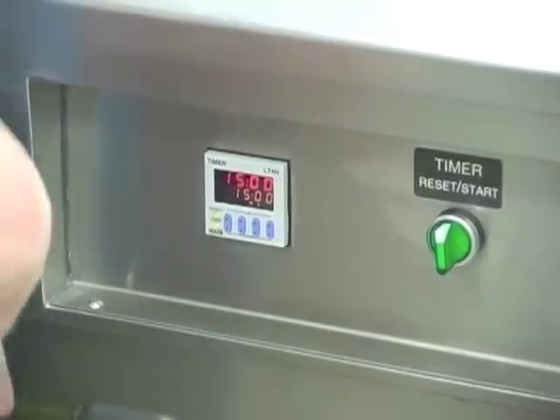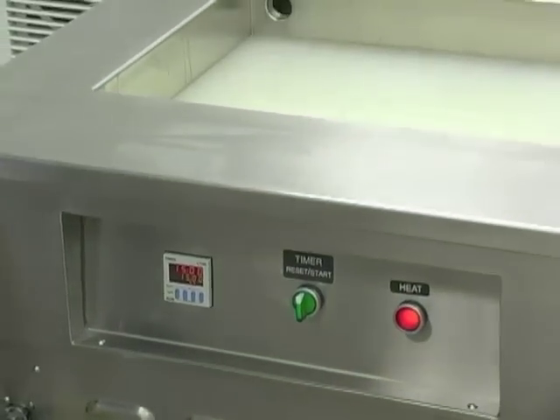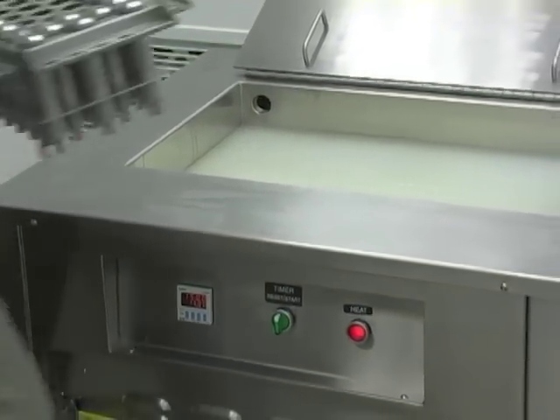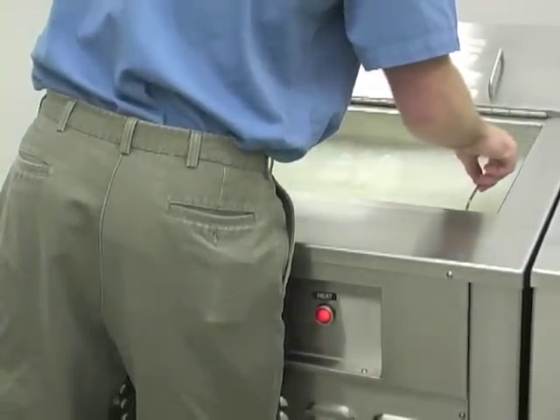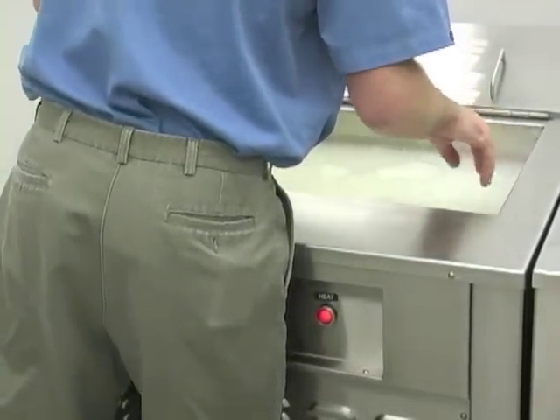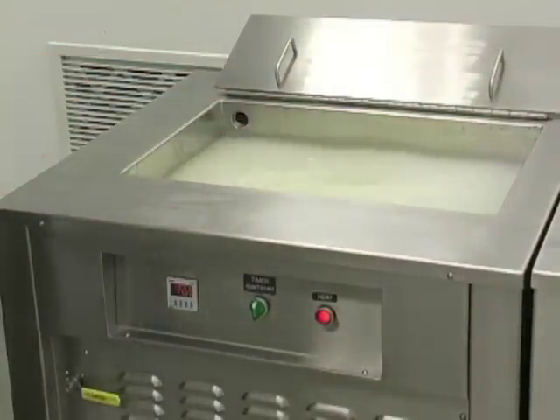Now we're going to insert the tools into the tank. Open the lid. Take your tray of tools and set them in — they rest all the way down to the bottom. For ease of removal, if you let your handles lay back up against the sides of the tank, you're better off.